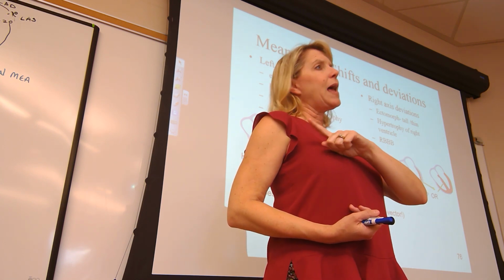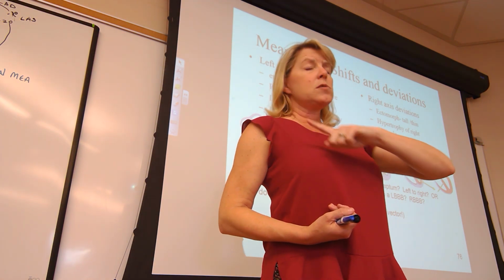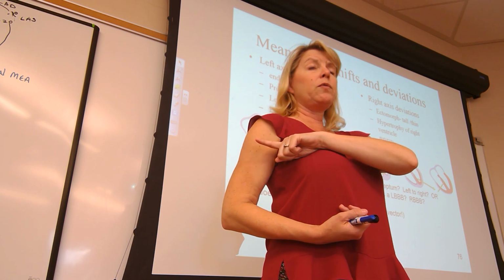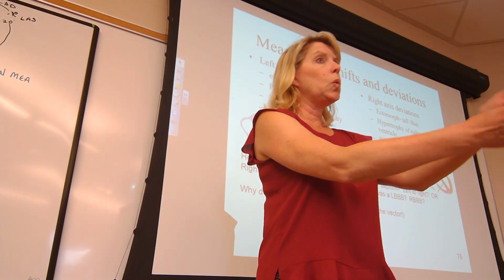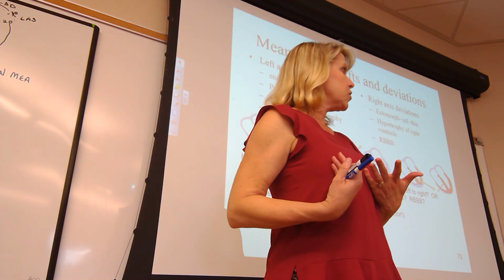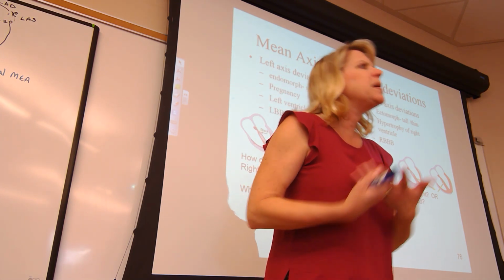So a person with an MEA that is way over here at, say, beyond 110 to maybe 140, that means the right side is sitting there waiting for the electrical current to get there longer than it should.